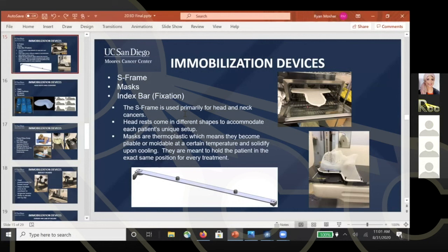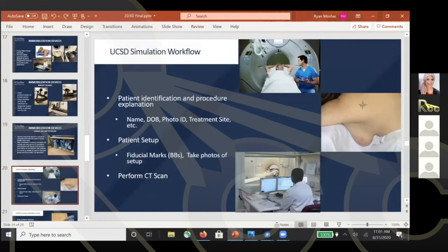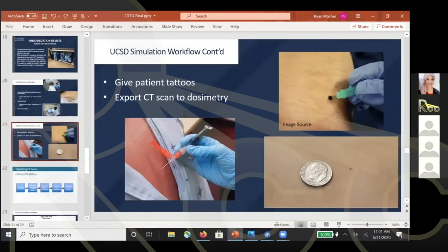Okay. So last question, which is important, and many asked it. Should we make another new tattoo after doing the shift in the first setup regarding the real ISO center or true ISO? Should we tattoo at this point when we shift to the new and real ISO? Do you tattoo it or just mark it and say it's 2 centimeters below the reference point and that's it?